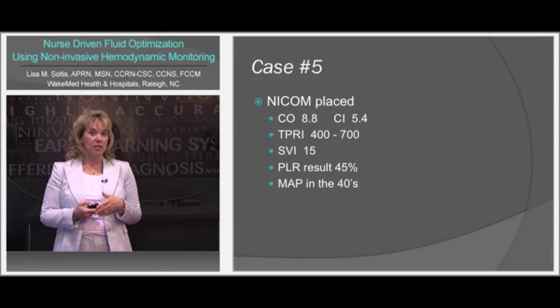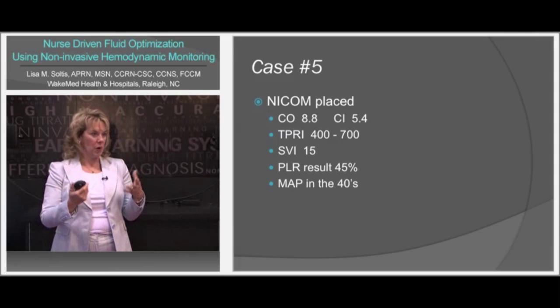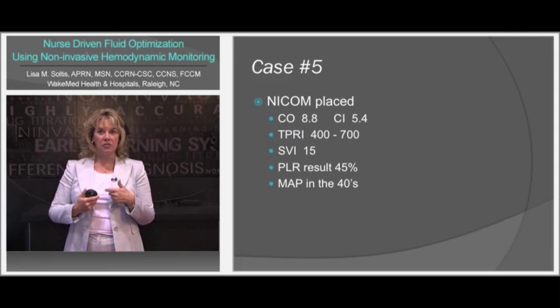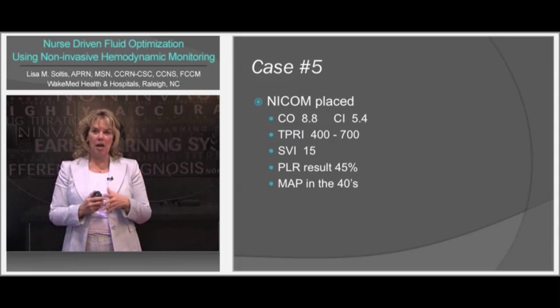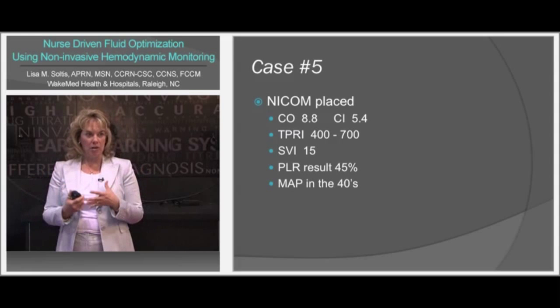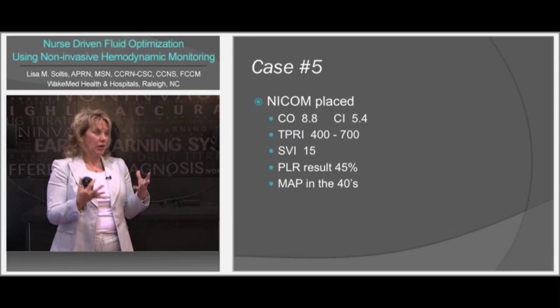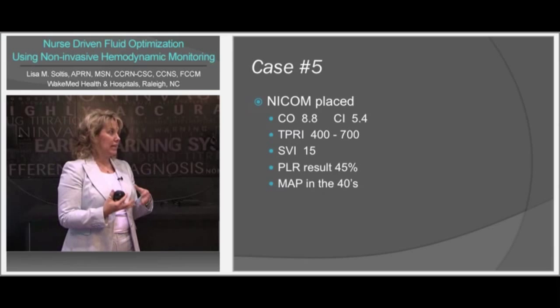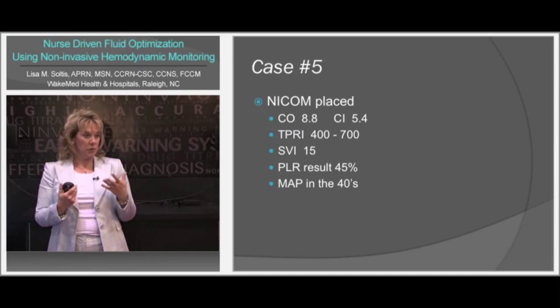Now, I had a conversation with the nephrologist, who wanted to give a 250 bolus to try and volume resuscitate. We collaborated as a group, and again, we had a multidisciplinary group there, and we all really agreed that this patient needs volume and he needs a lot of it, so we decided we were going to aggressively fluid resuscitate and see if we could make a difference.